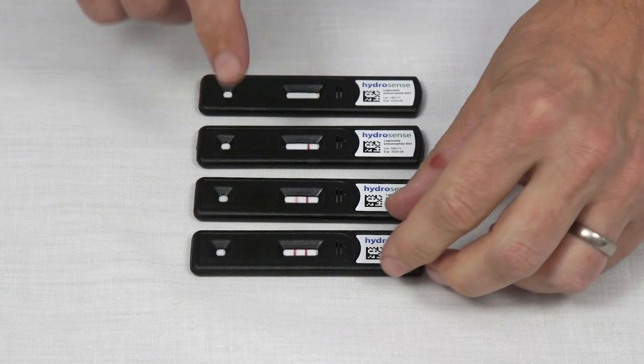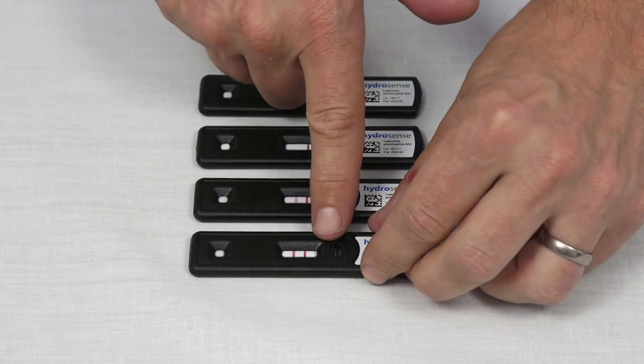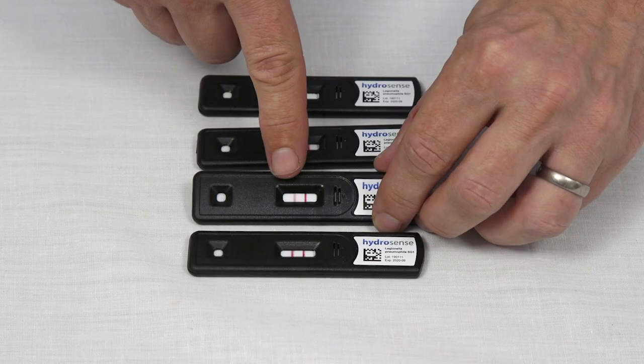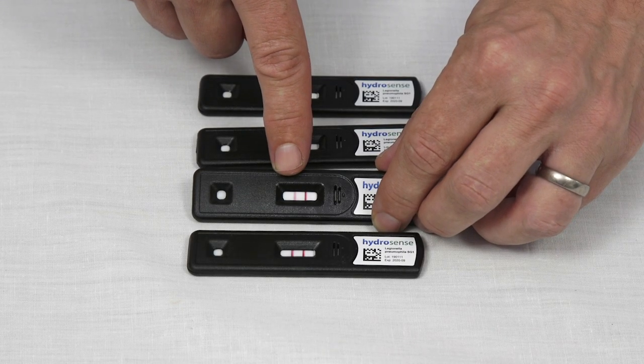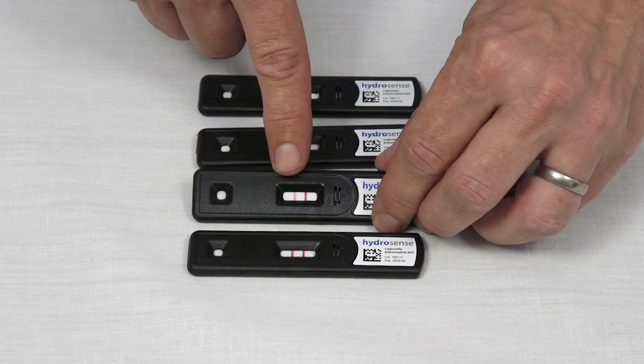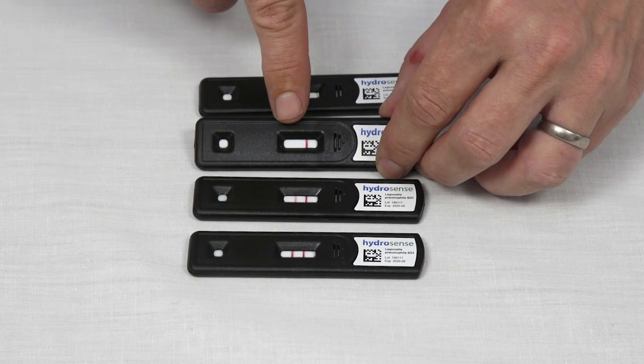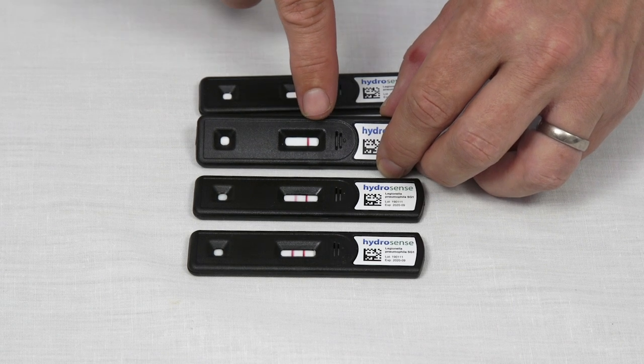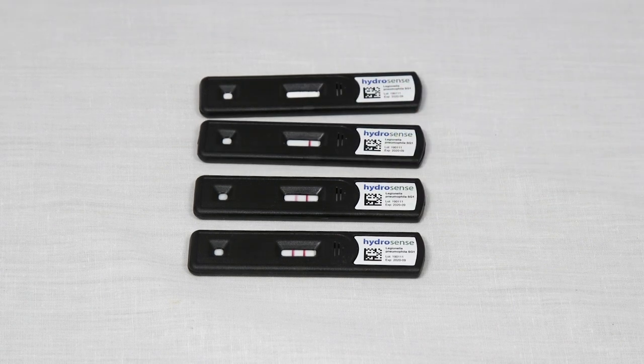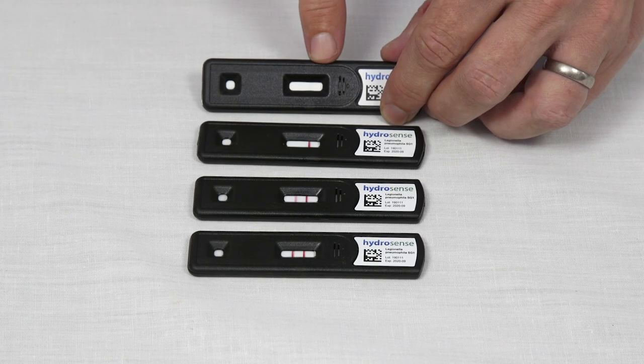After 25 minutes of running time the test can be read. The test is composed of two lines, a test line and a control line. If both lines are present then Legionella pneumophila serogroup 1 has been detected above the cutoff of the test kit. The positive signal at the test line may well be weak but any line at this position indicates a positive. If no test line is present at the test line position but there is a control line then the test is negative and Legionella pneumophila serogroup 1 has not been detected. If no control line is present then the test is invalid and it should be repeated.